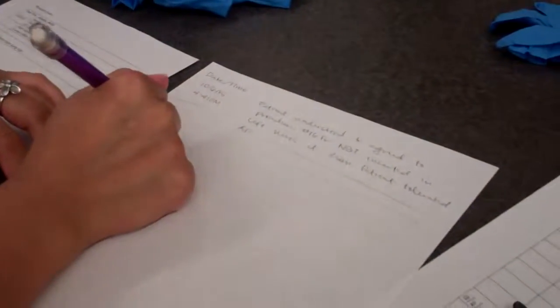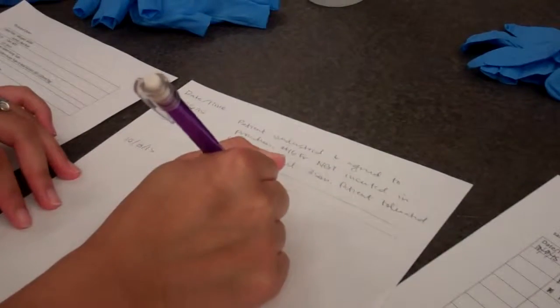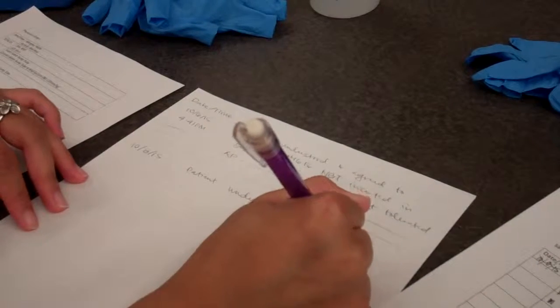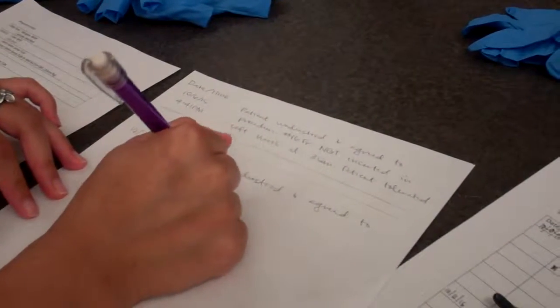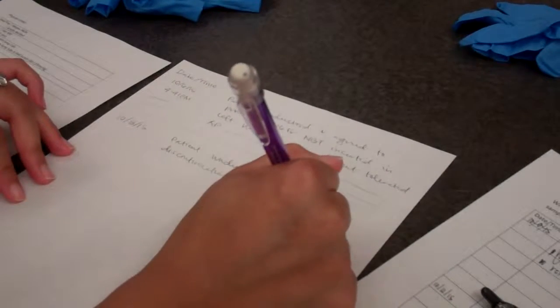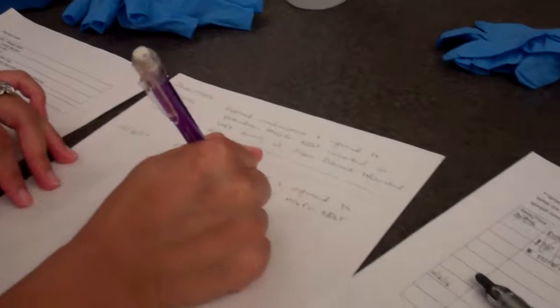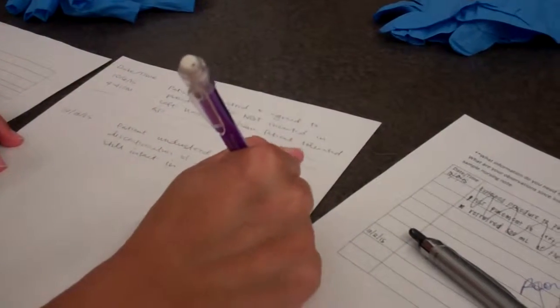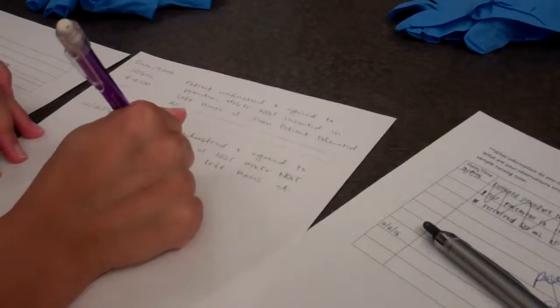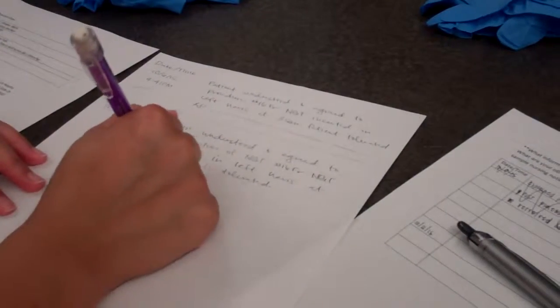Wash my hands. So on 10, 8:15. Patient understood and agreed to discontinuation of NG tube. Number 16 French NG tube still intact and left nare at 35 centimeters, patient tolerated. Okay, and then I would also initial, and then I would make sure no extra lines are available so no one else can sign it. And that completes our procedure.